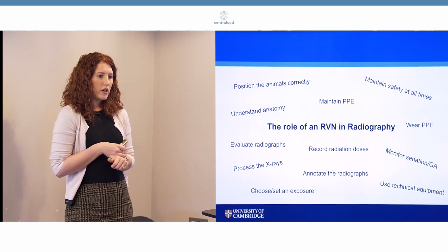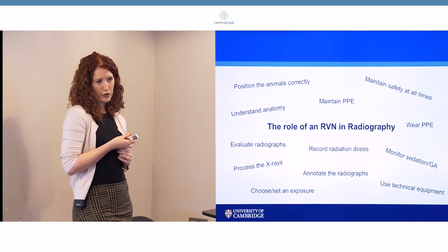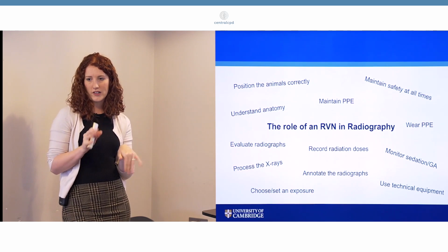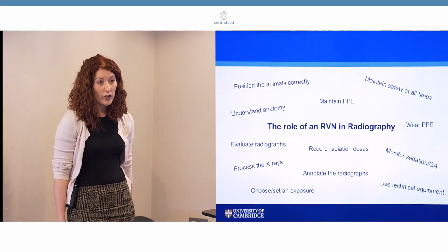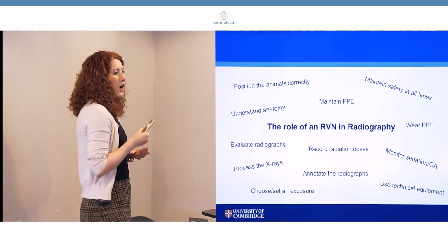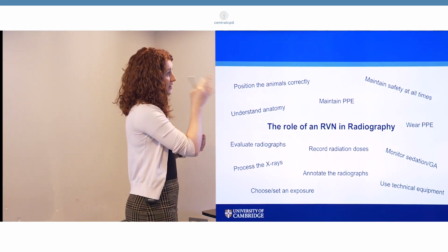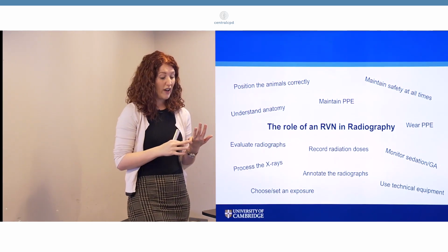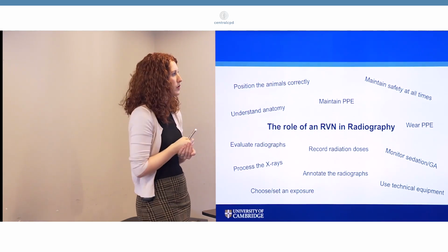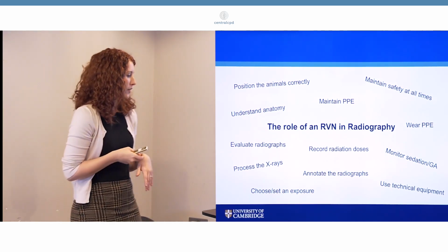What about PPE? Do you have anything to do with the lead gowns and things like that? Are any of you responsible for, no? I know some people are responsible for maintaining the PPE as well, but just making sure you wear it, and anyone else that is working with you. I'm really sorry, I've forgotten your name. Jenny. You also mentioned annotating the radiograph. By that I mean looking at them, putting your markers on if you haven't already, flipping them, doing whatever you need to do with them. So you do all of that. And on top of all of that, normally you're monitoring your patient as well. So it's quite a huge amount to get going.